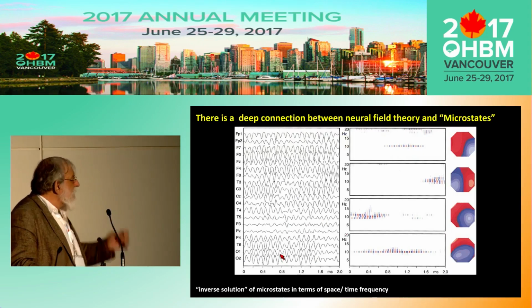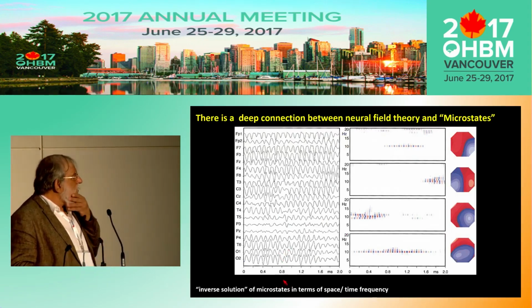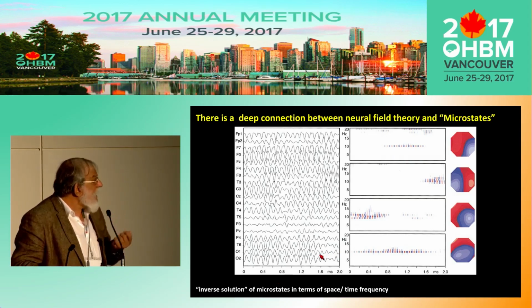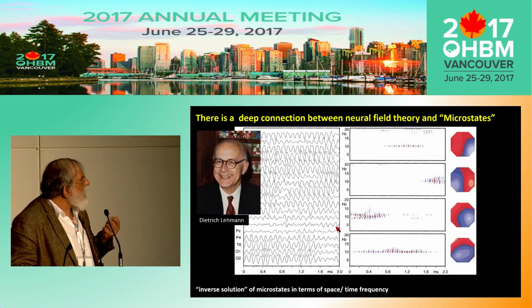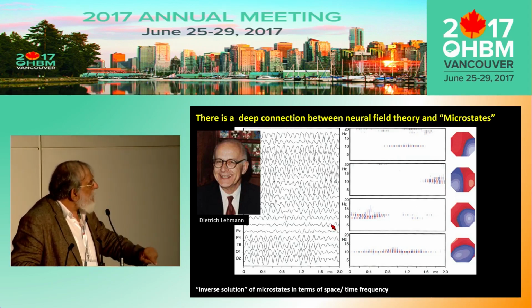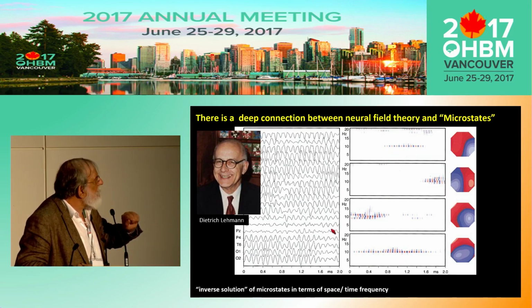I do want to mention that with Thomas Koenig a number of years ago, we tried to pose the frequency, space and time evolution of microstates as an inverse problem. There's an interesting paper out there, and this is my tribute to Dietrich, who really was an inspirer of all of us. Now, in this case, we have alpha activity that corresponds to several microstates.